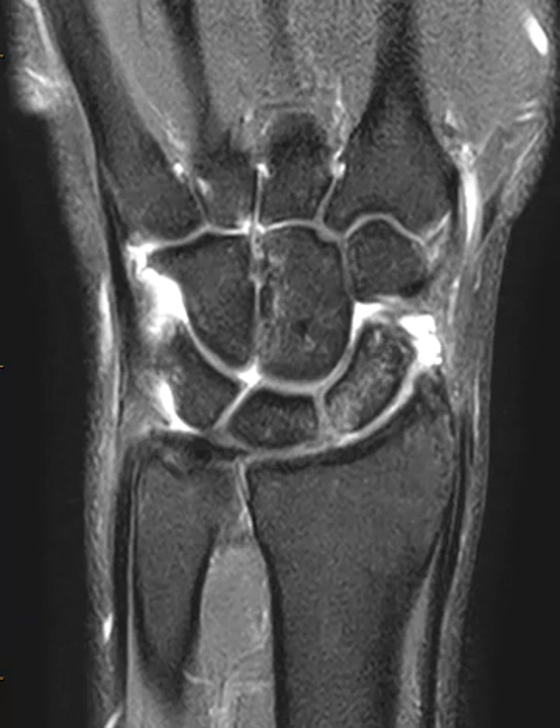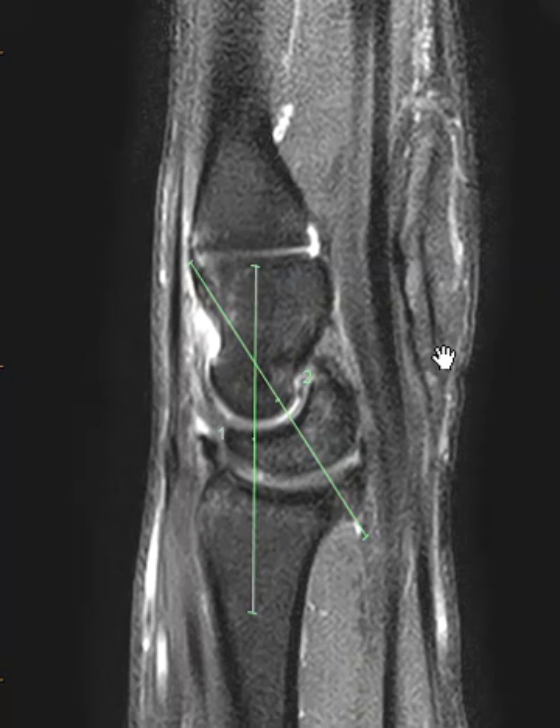Now we're going to go to the sagittal view to look at the capitate bone and the orientation relative to the lunate bone. This is the lunate bone — it looks like it is tilted dorsally at this angle. We have the angle of the capitate bone here. We should see the lunate bone as a cup, perfectly positioned underneath, with a nice straight line between the radius, but instead it looks like the lunate bone is subluxed in the palmar direction. We see it is tilted backwards, so we have an abnormal angle here — this is about 35 degrees. Normally this should be less than 30 degrees, so we know that they have ligamentous instability.